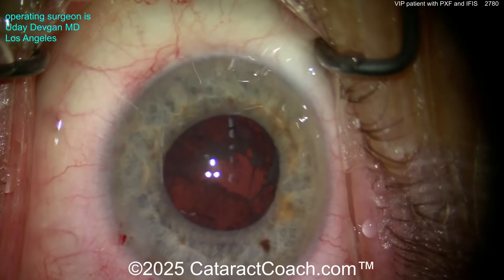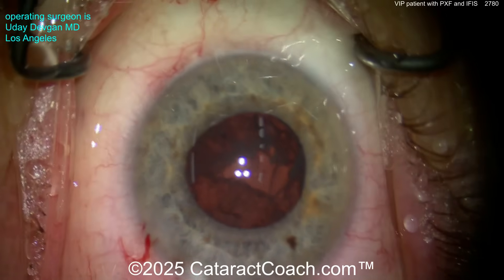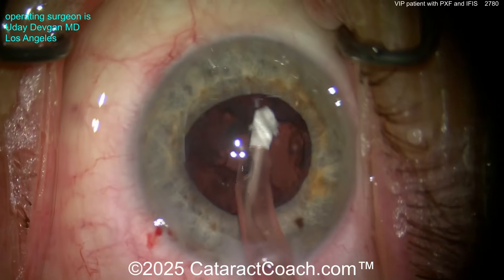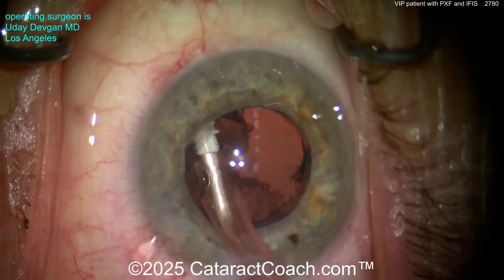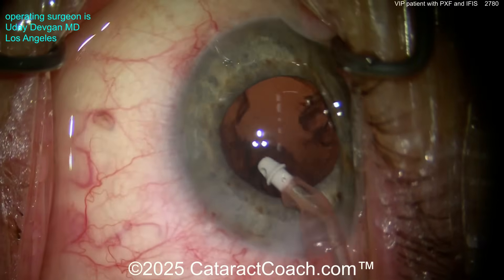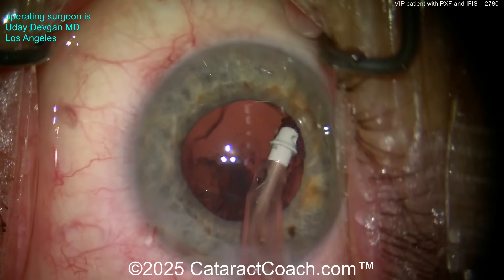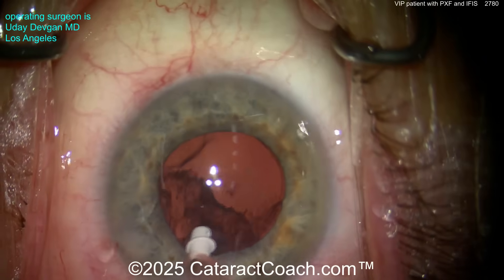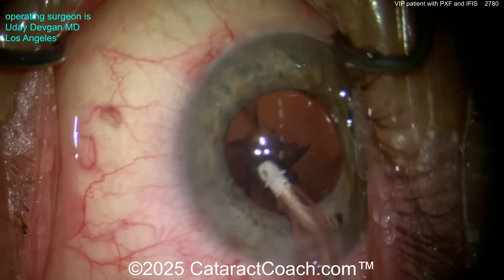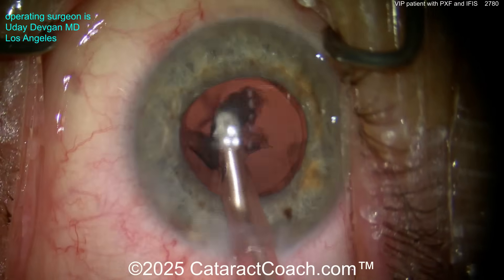Now look at the pupil coming down a little bit — maybe about four and a half millimeters at the moment. We're ready for I/A to remove the cortex. Keep track of the cortex as you aspirate: go systematically in a clockwise or counterclockwise manner. Also look carefully at the capsulorhexis edge — as you remove cortex, the rhexis margin should not move at all. If you see the rhexis edge moving even a little bit, that's indicative of zonulopathy, and this patient with pseudoexfoliation could very well have that.